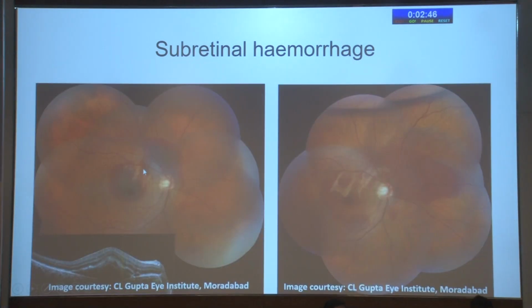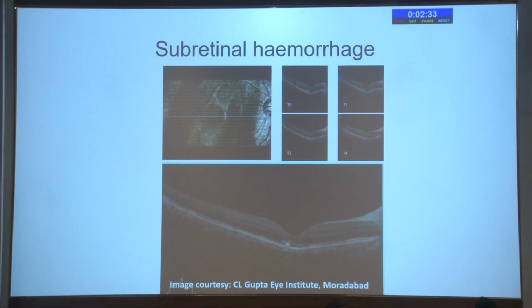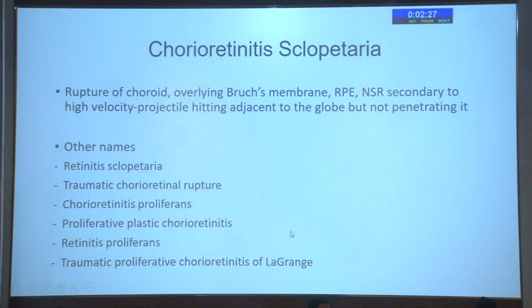So this is a patient who presented 3 days after severe trauma with subretinal hemorrhage. We treated the patient with intravitreal 0.3 ml 100% SF6. And at 3 months, the subretinal hemorrhage dispersed from the fovea. So this is the final OCT with a little bit of damage remaining.